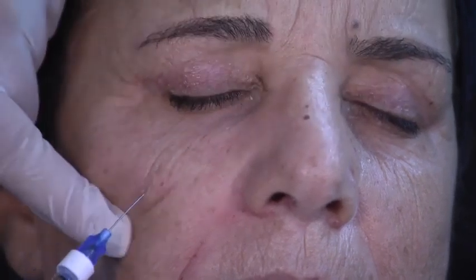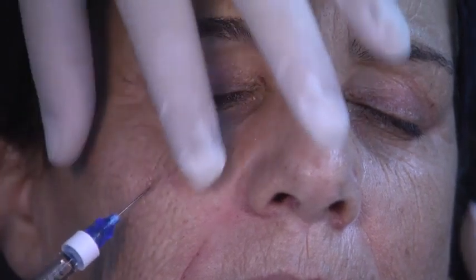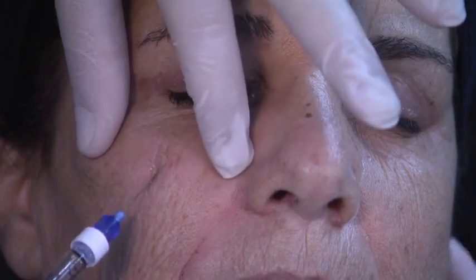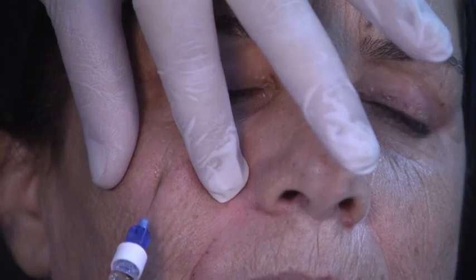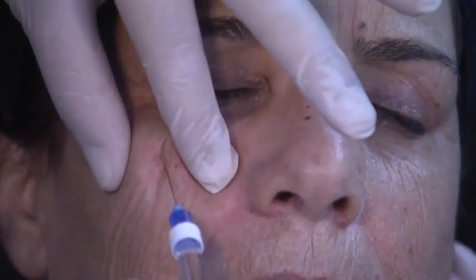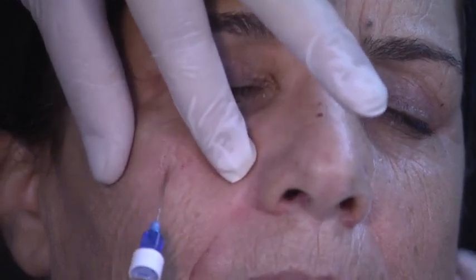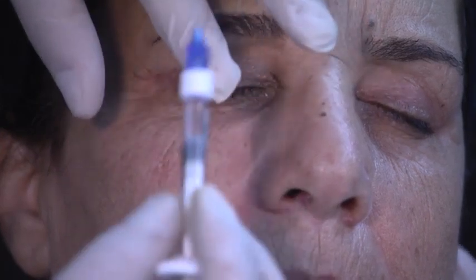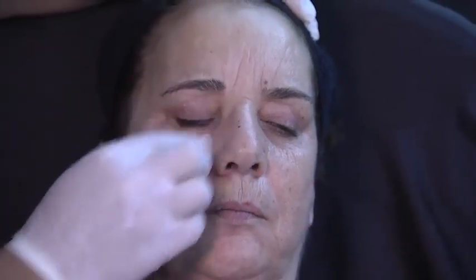Now, this is molding at the same time. Okay? If I'm using this product, I will never do a superficial deposit like I did with Vital Light. Okay? So I keep going lateral, the same technique. And I keep going lateral for the palpebromalar groove. Okay? That's it. Total of 0.5. I still have 0.5. And I'm not only doing tear trough, I'm also doing palpebromalar groove. Right. Okay?